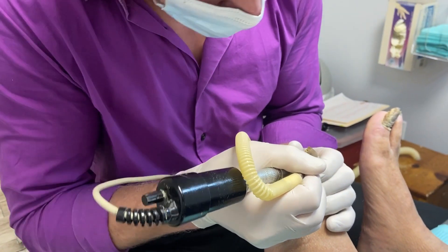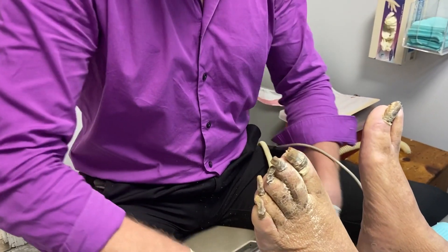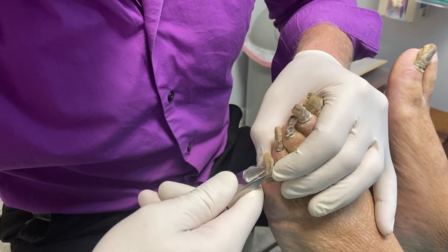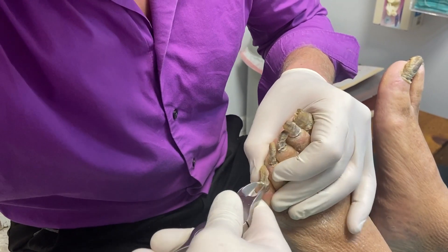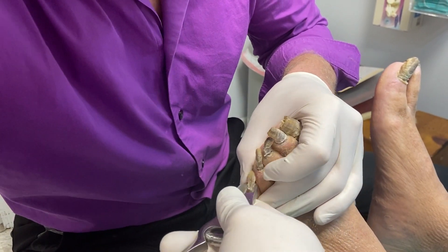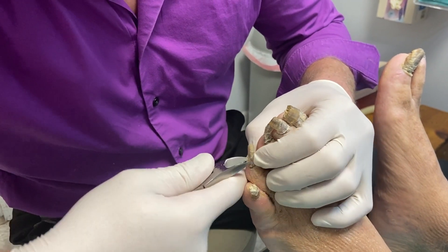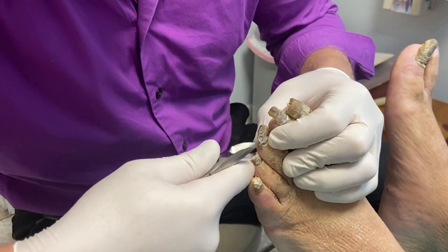Here I'm using the burr to debride the nails just a little bit to get some thinning at this spot, so it's easier for my nipper to actually work. When I use the nipper, I can put a lot of torque on the nail, which would twist the nail and cause pain to the patient. By using the burr and scoring it over the line where I anticipate cutting, that makes it easier for the patient.